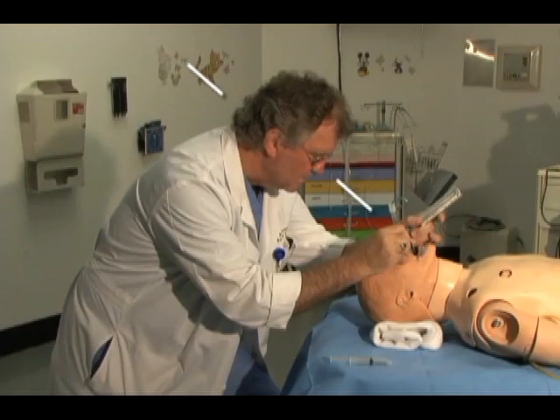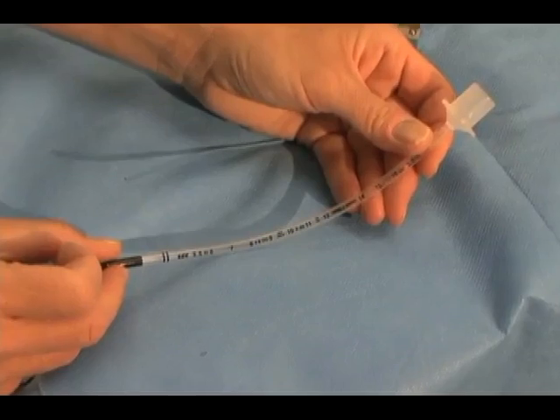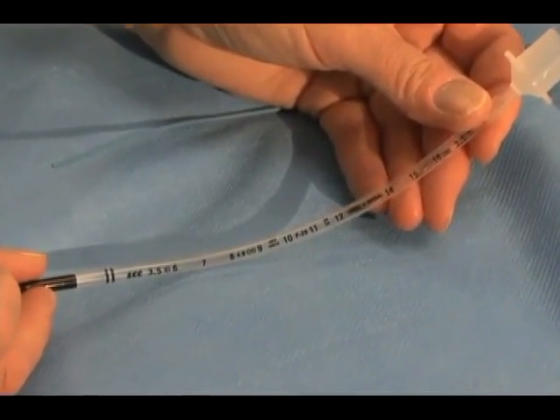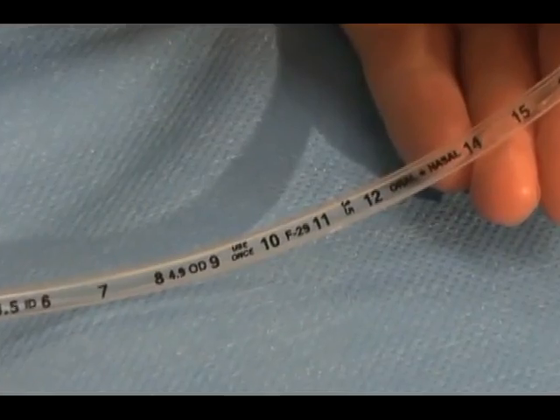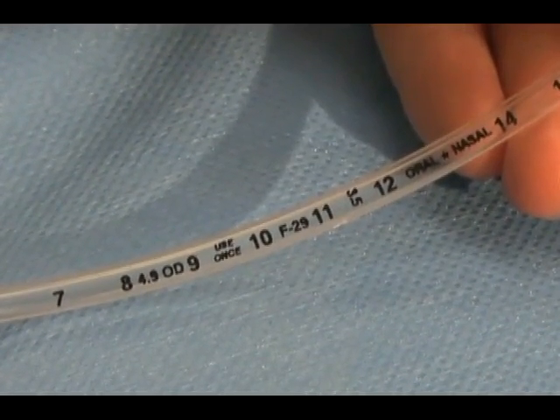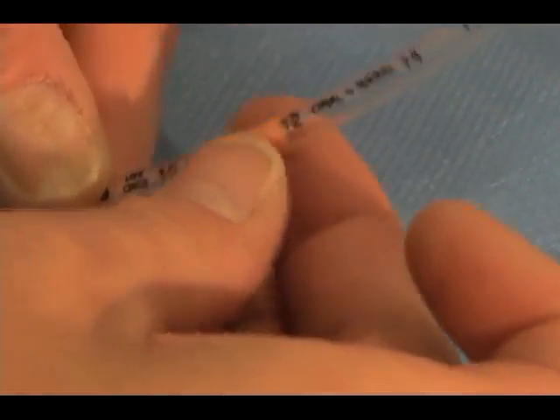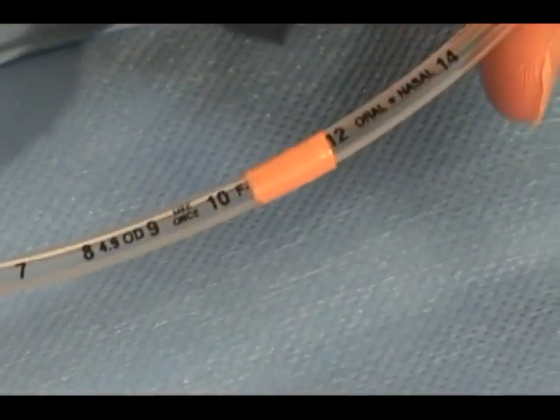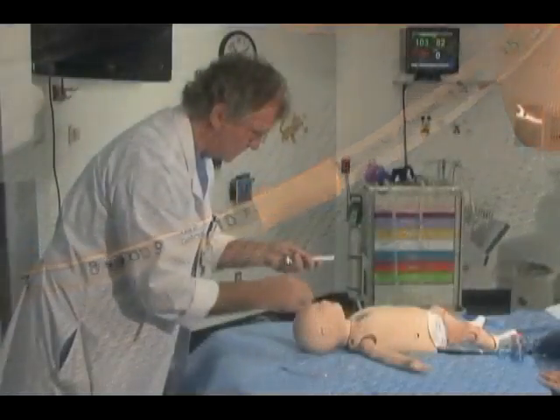Prior to a pediatric intubation, the ET tube should be marked clearly with tape at the appropriate lip-to-tip distance. This will serve to orient the intubator to the correct ET tube insertion depth for this patient. This is a 3.5 millimeter ET tube, so the tape is placed at approximately 10.5 centimeters.